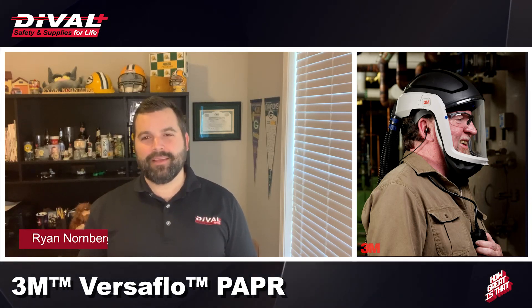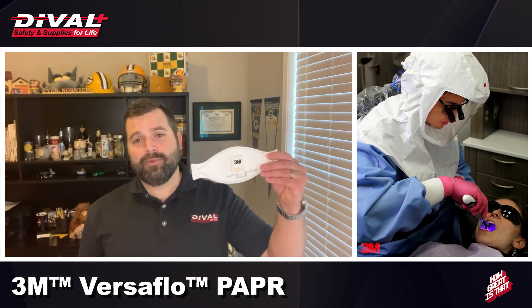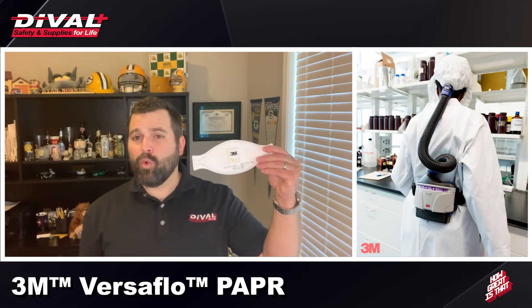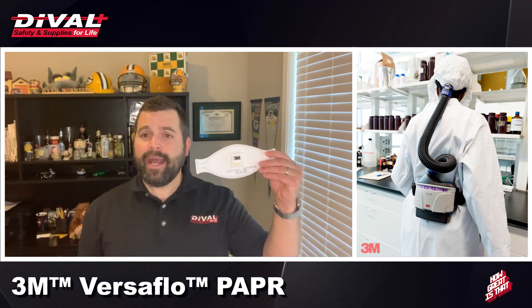If 2020 has taught us anything, it's the importance of respiratory protection. A majority of the news has been centered around the humble N95 respirator, and while this is a wonderful piece of protective equipment, it has its limitations.